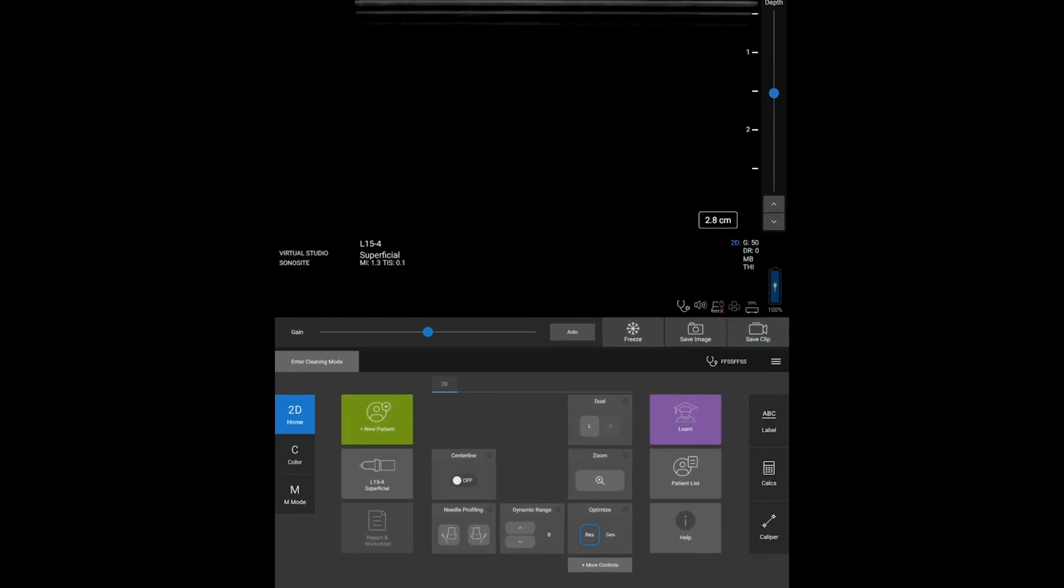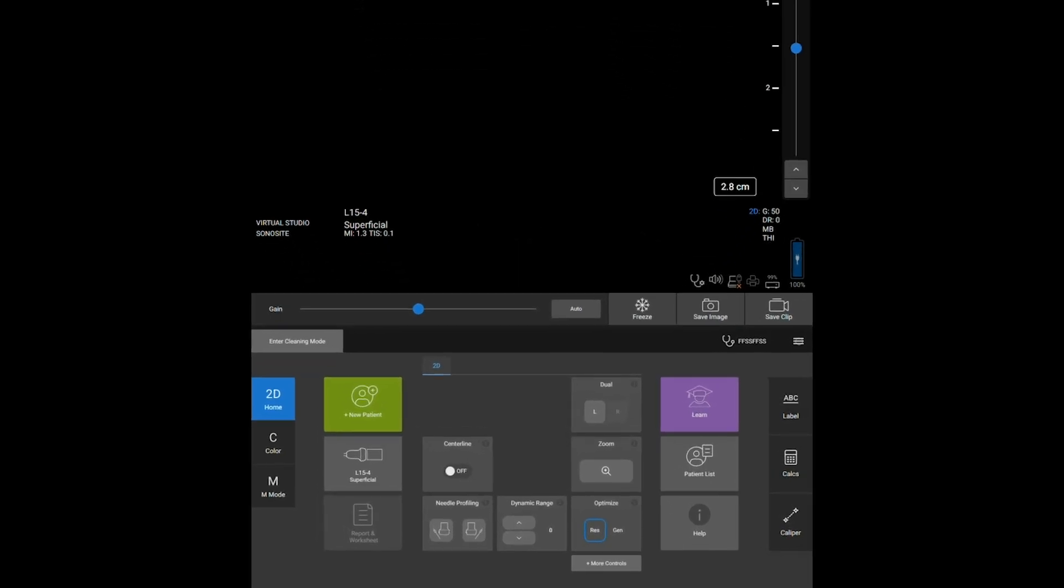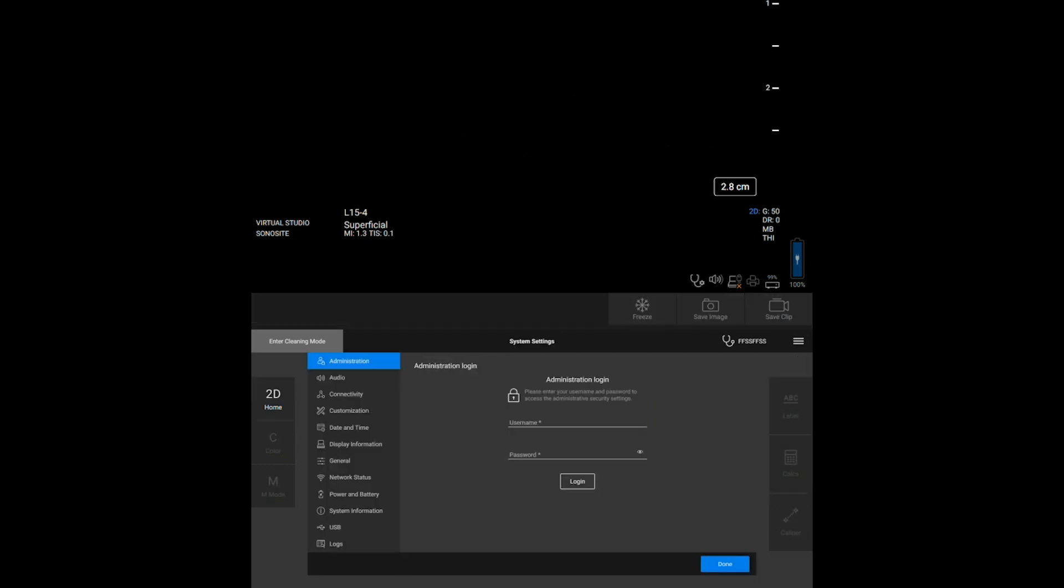To access the system settings, tap System Settings from the menu. From the Settings page, you can configure things like sound, connectivity, and display settings.